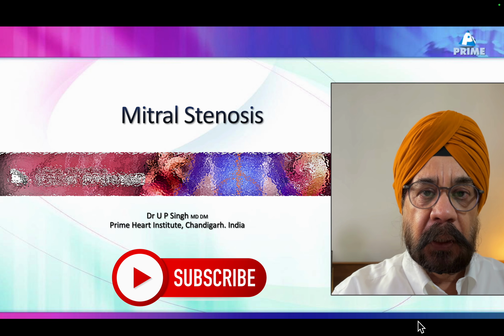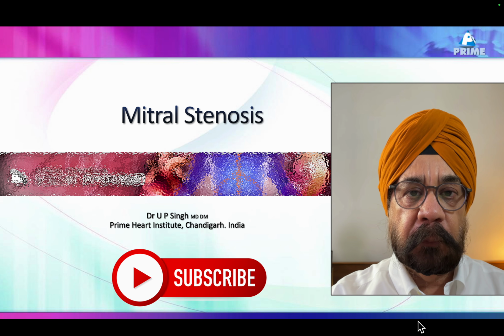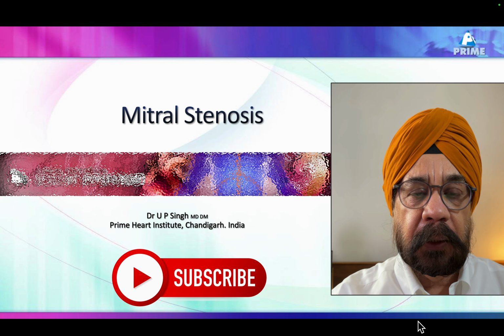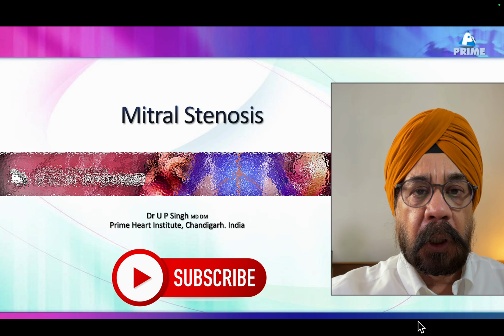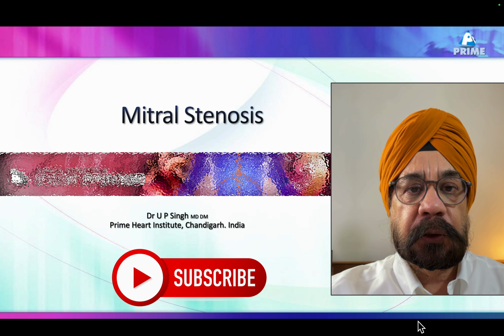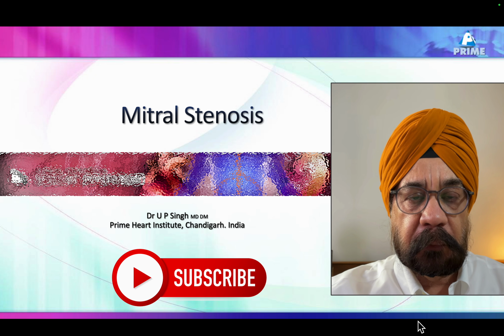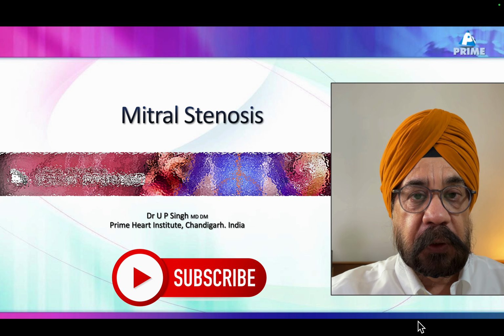Friends, I'm back again, and I'm showing you a case of mitral stenosis, and I just want to share with you how you would actually make an assessment in mitral stenosis. Mitral stenosis is pretty common in our part of the world, so we see it very frequently.